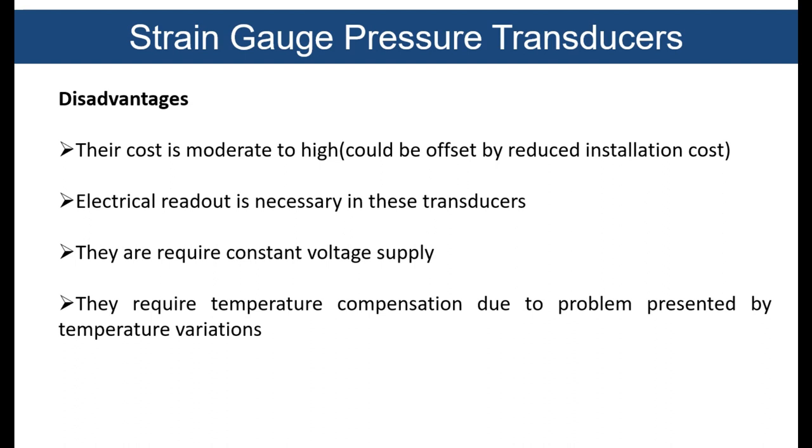As we have seen the advantages, we have disadvantages also. On the disadvantage side, their cost is moderate to high, so it's not very cheap. Sometimes if you want to buy a very good quality strain gauge, it will be very high in cost, starting from medium level, so we cannot afford these every time.